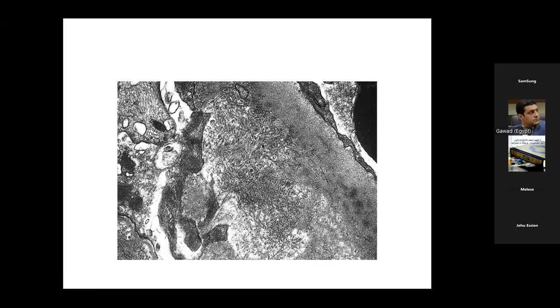These are the fibrils, and we have, unfortunately, to measure the diameter of these fibrils to differentiate between amyloidosis and fibrillary GN. That's why I see that the differentiation with the special stains, the Congo red stain, and immunohistochemistry is much easier, and I think much more accurate than measuring these thin fibrils.